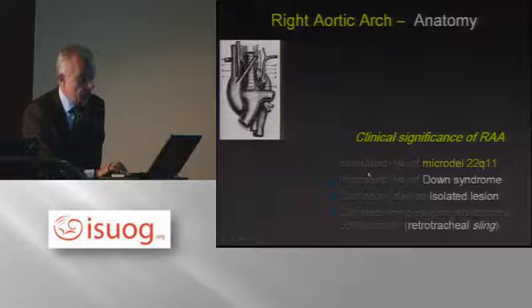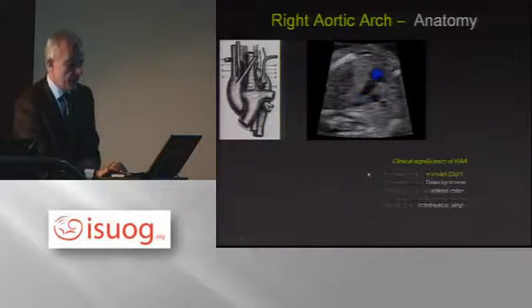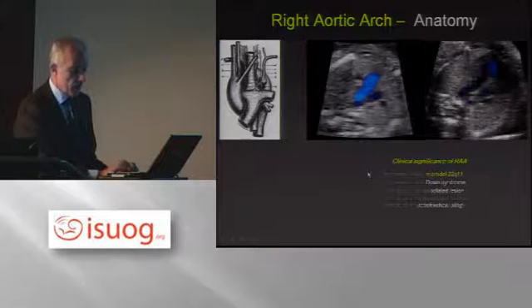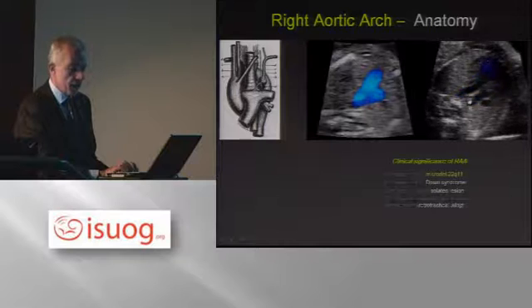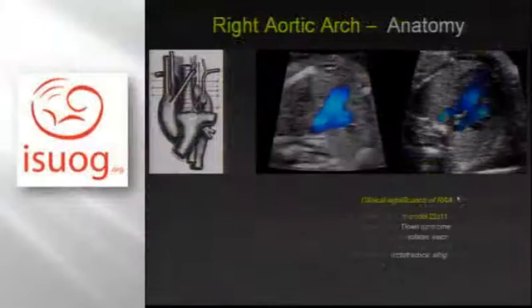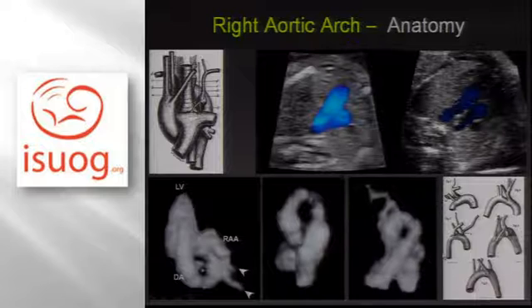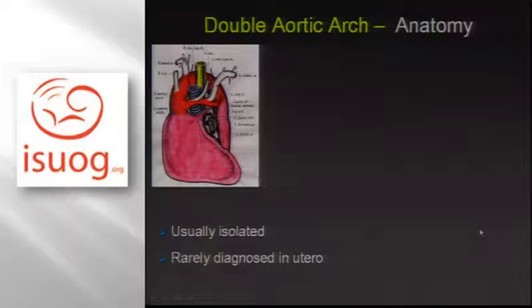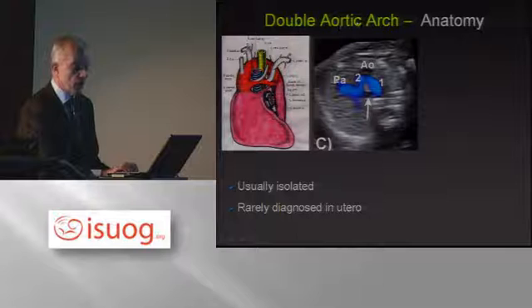It goes without saying. Also, coming back to the right aortic arch, this is how you can detect it by using color Doppler. This is a normal arch, and this is in comparison with the right aortic arch, in which the trachea is in the middle of the two arches, the ductal and the aortic arch here. And in this case, you can use 4D technology just to study the branching pattern of the neck vessels. And also to confirm diagnosis of such difficult cases of double aortic arch.